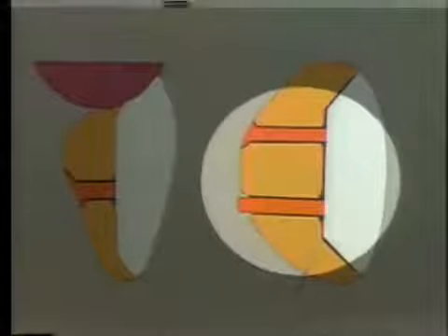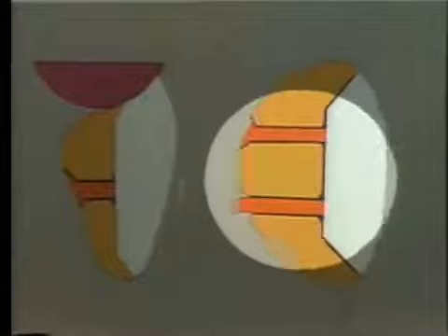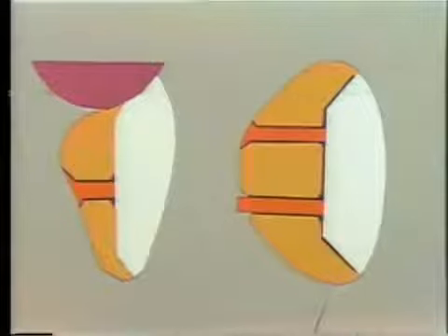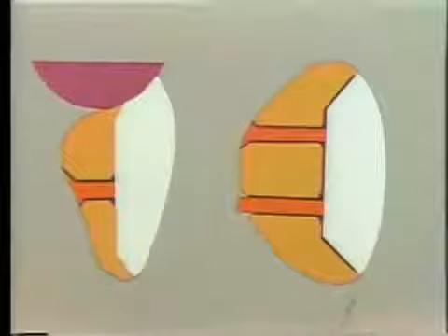The porcelain is beveled so that the gold comes forward and meets the porcelain on the labial surface here, and the same is done on the other side. This gives the adequate amount of gold here for the contact relation, for making the soldered connector, and the position of this is quite strategic.